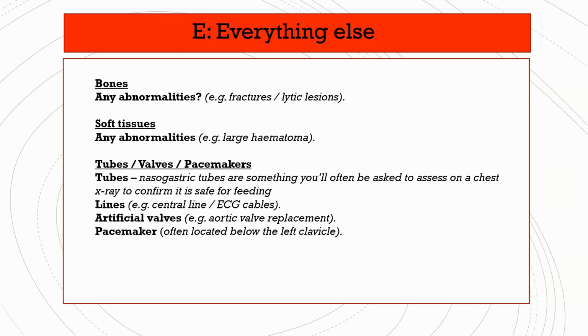Right, and everything else, I promise you there's not too many things in there, but make sure you check the bones. Are there any abnormalities? Because if there's a metastasis on the rib, you should be able to see it, that would be good. And if there's a fracture, the doctor wouldn't give you an X-ray with just like everything's fine on the chest, but actually he has a fracture in the arm. But one doctor did that to me and I was completely thrown off. But he wasn't expecting me to pick up. He was just like, this is an interesting X-ray. What do you think? So yeah.